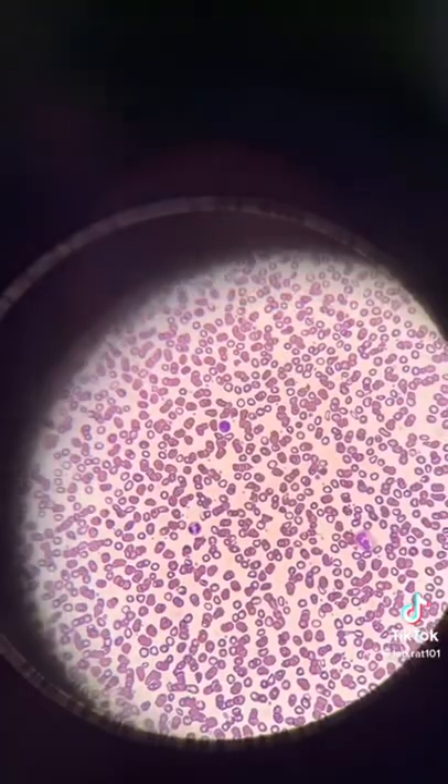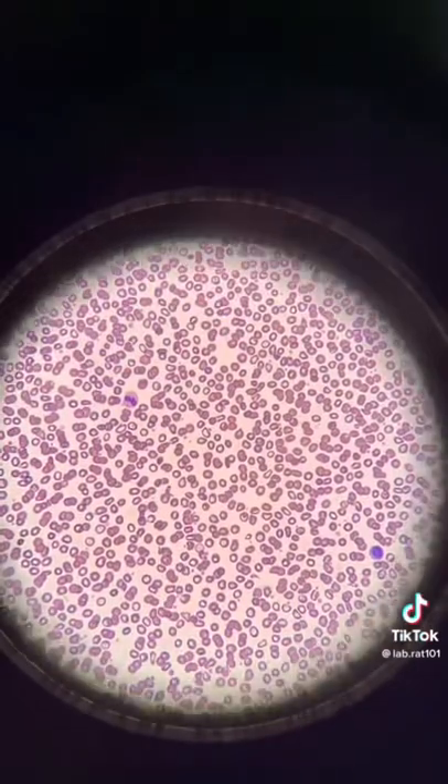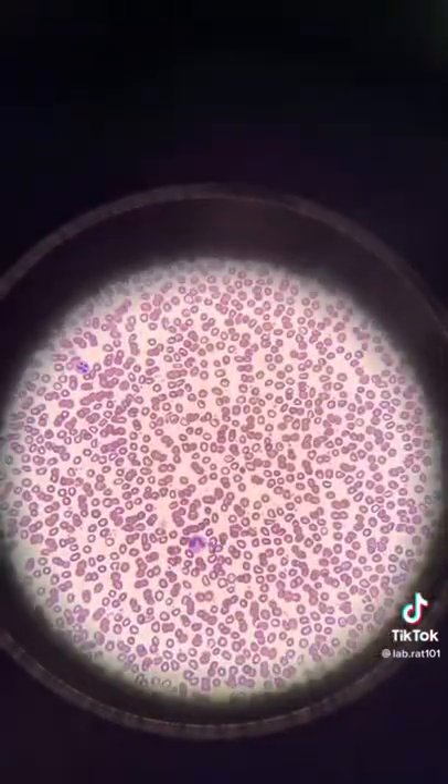Then I stain it, and after you stain it, it comes out looking like this. It was kind of hard to record this, but here you go.